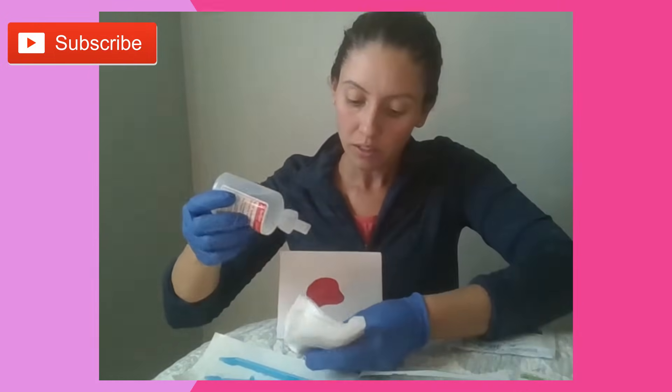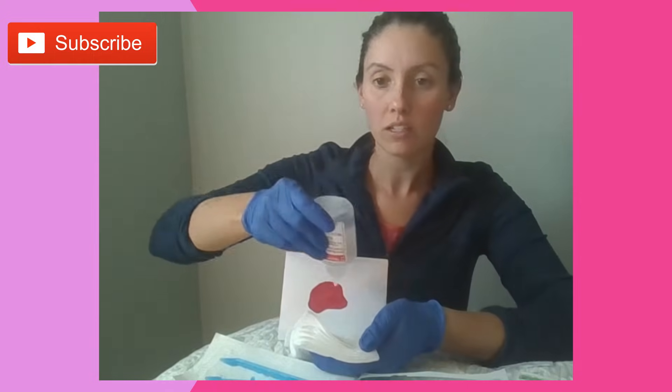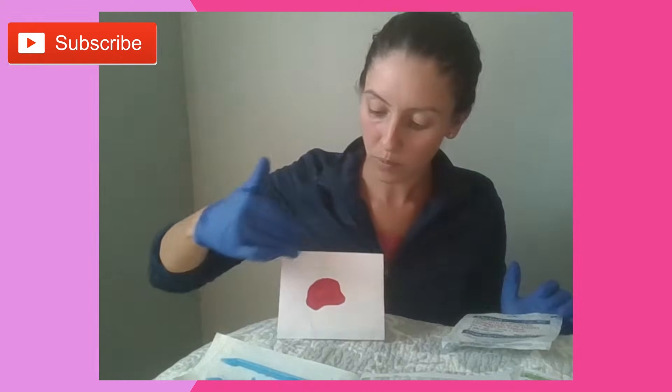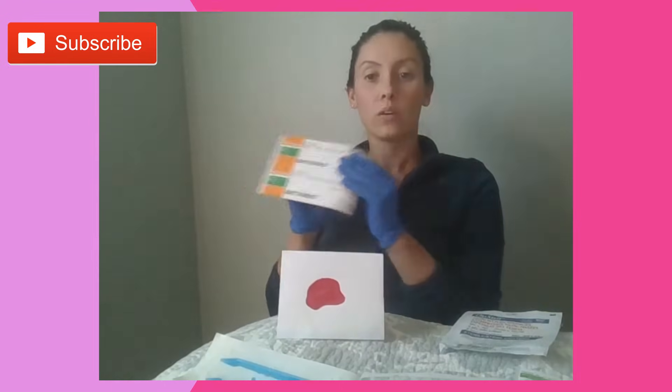The first thing you want to do is wash your hands — either wash them or use hand sanitizer. Then you're going to put on your gloves — just clean gloves, not sterile. Next, you are going to wash your wound. Take the saline, take your gauze, and rinse the whole bottle of saline. Sometimes you want to have the patient use a towel if you're in a community setting, or have lots of gauze. Pour through the whole saline bottle. When that's done, you can use a sterile gauze to wipe around it to remove any excess saline.